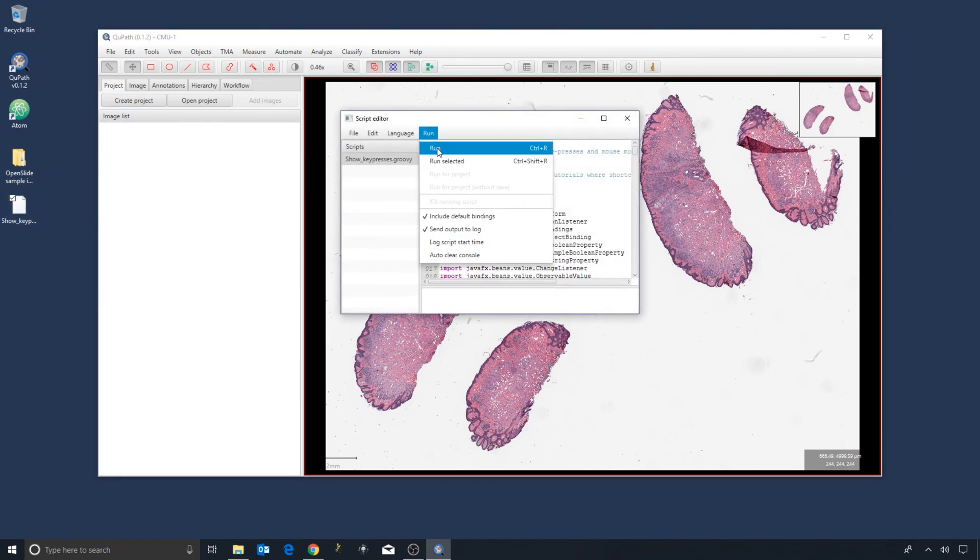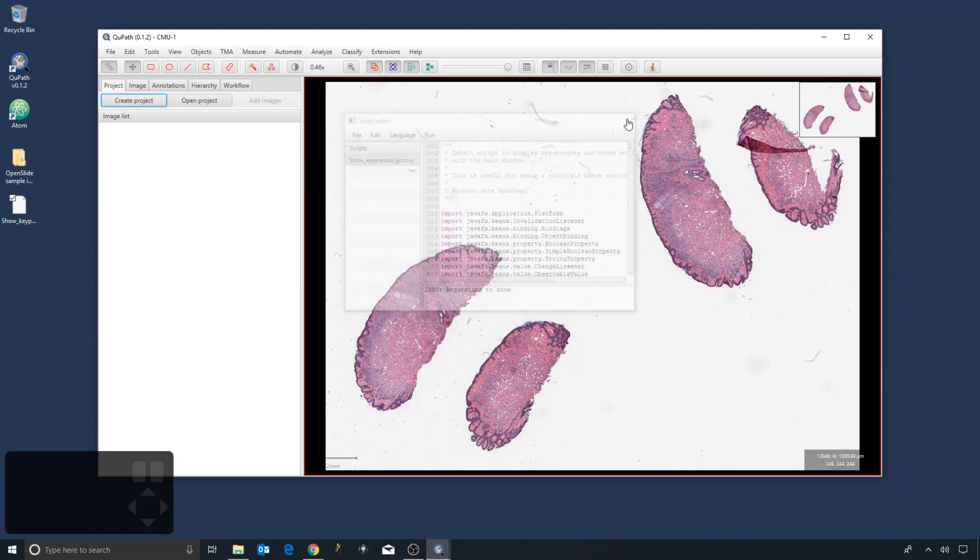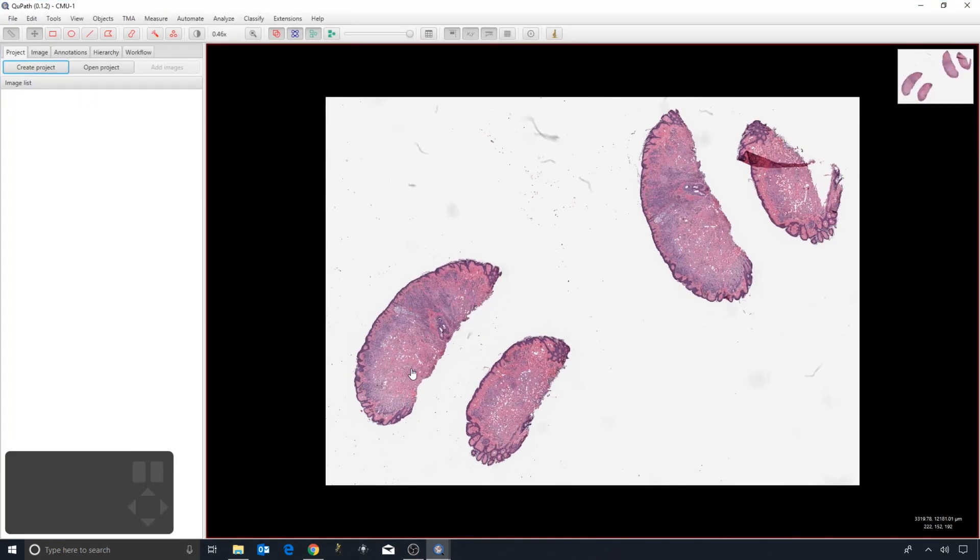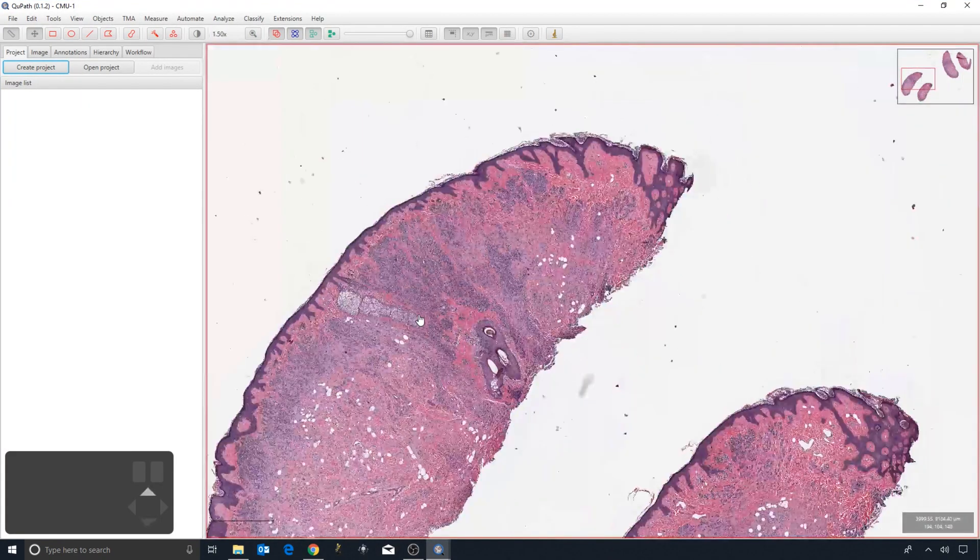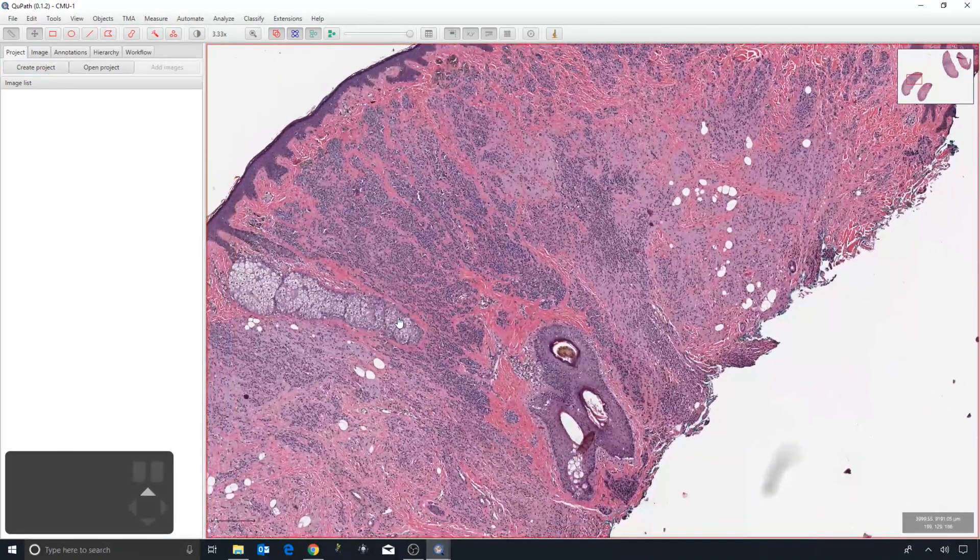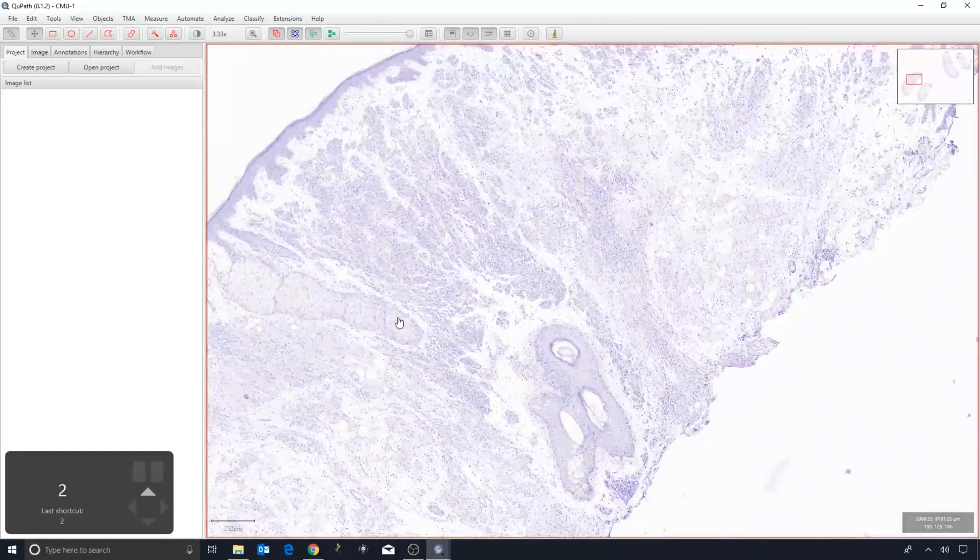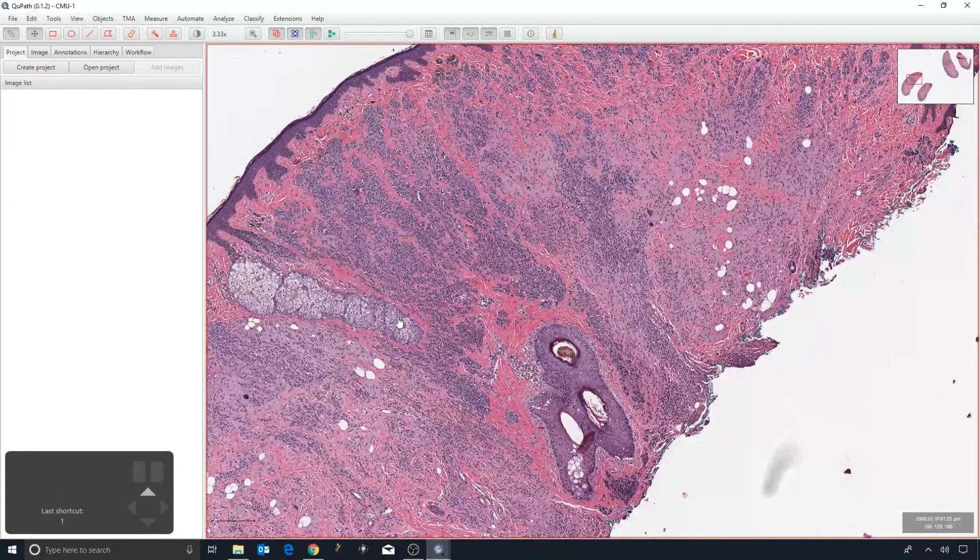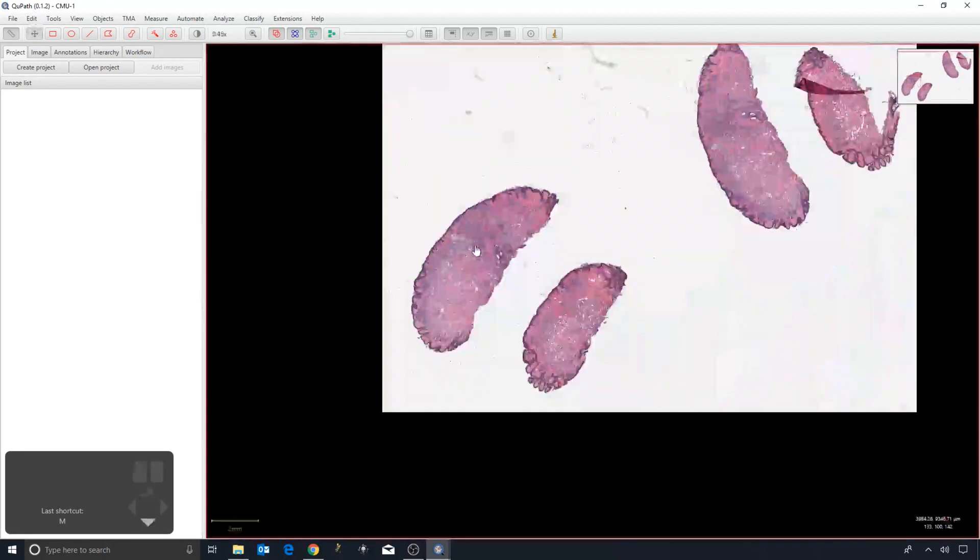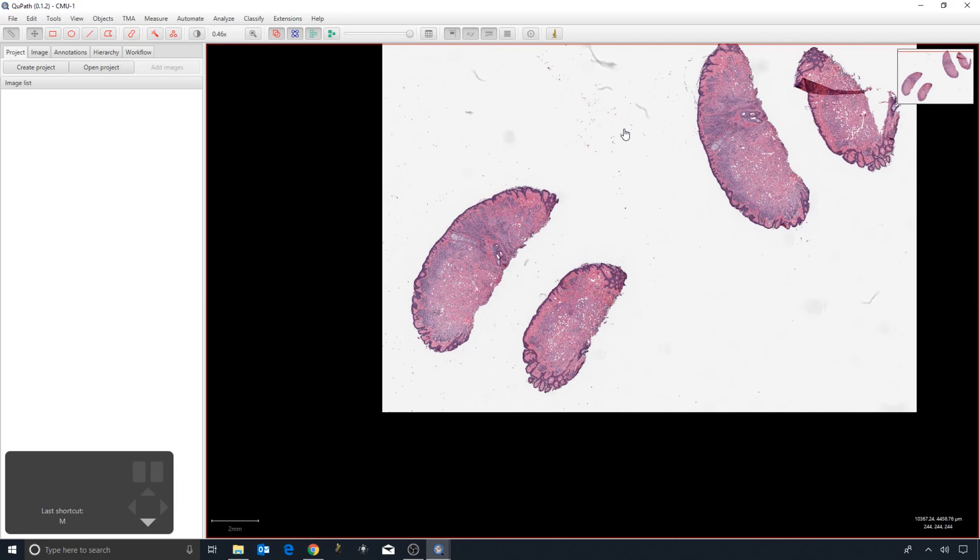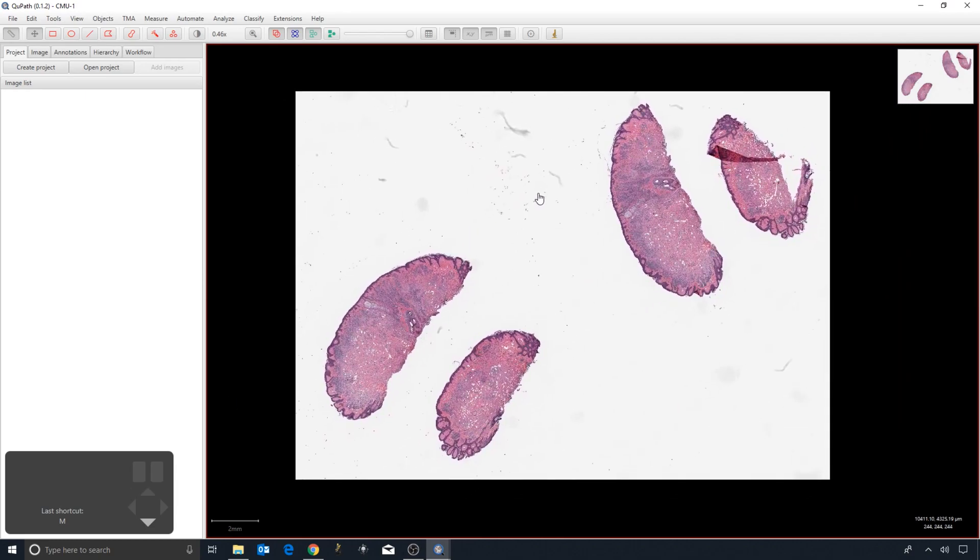...out of force of habit, you'll be able to see what keys I'm pressing. So I'll press the keys to separate the stains, you'll be able to see them. Press M to move around. If you look at this window in the bottom left, you'll see the shortcut keys that I press.